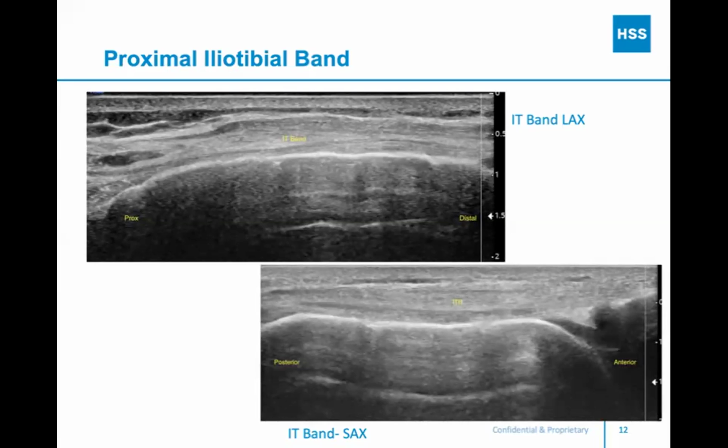Beyond that, more anterior, if you see fluid, I would be highly suspicious of a joint pathology versus IT band pathology. I think that bears mentioning because we frequently see trainees tripped up on this when they're scanning and presenting to us. They'll call fluid under the IT band, but it's really a joint effusion. So just remember that the central to posterior IT band is the IT bursa.